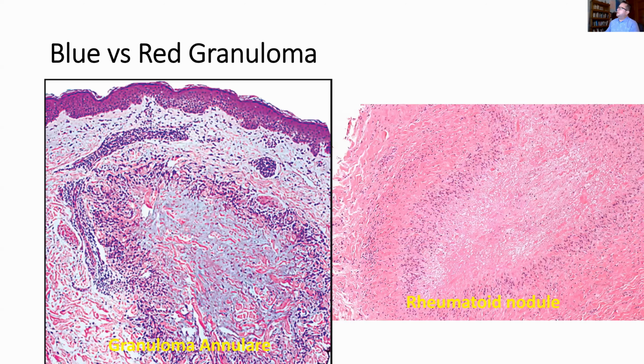So they have the degenerated necrobiotic material in the middle. They have the macrophages going around the edges. And then in here, this is pink staining, and here this is blue staining. This may be a mucin stain, but you will even see it on the H&Es.